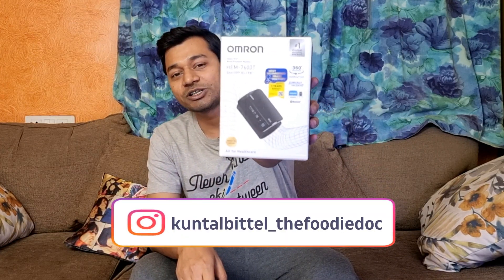This is our bag. This is the concept of OMRON HEM7600T. I'm going to share this with you and show you the features.